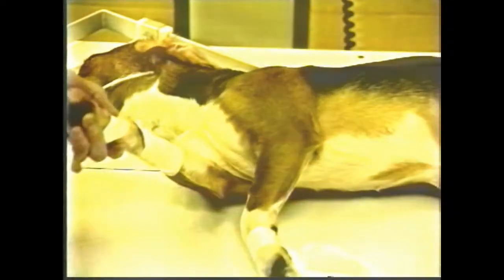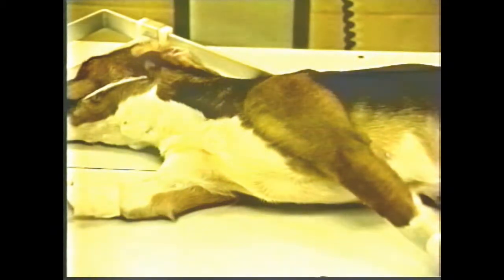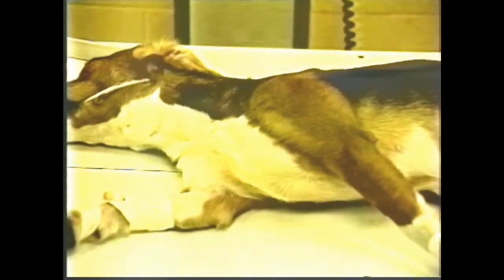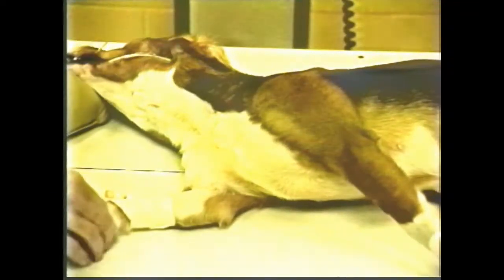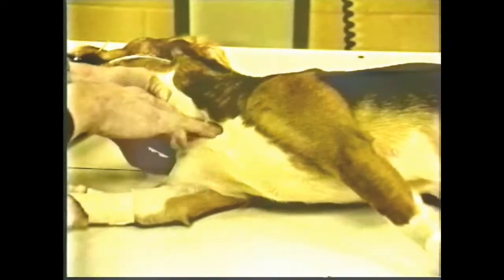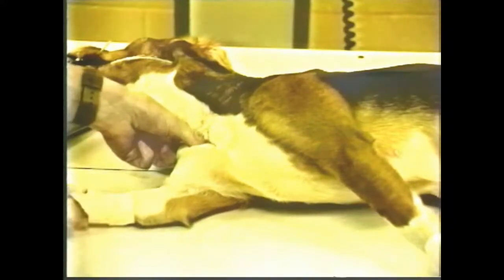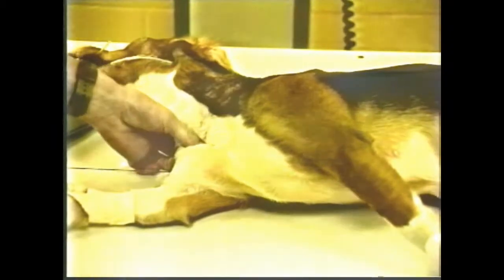Radiographs of the shoulder are much easier to obtain with general anesthesia or at least sedation. The shoulder of interest is placed down and closer to the film. The leg of interest is pulled forward, and the opposite leg, or one not interested in, is pulled caudally. Do not pull the upper leg back over the thorax, but keep it extended. The head and neck is then pulled in roughly a straight line with the upper leg so that the positioning is like a T.